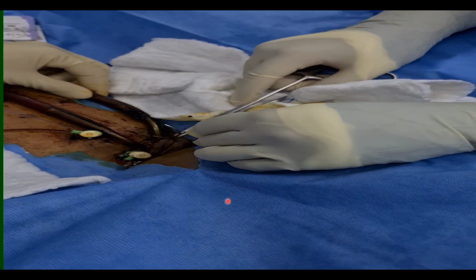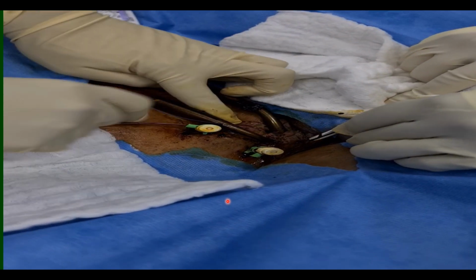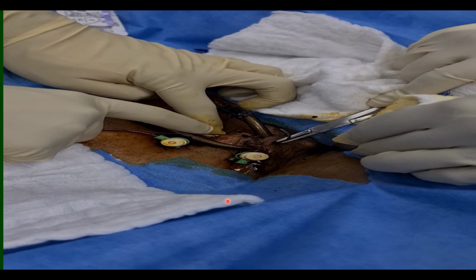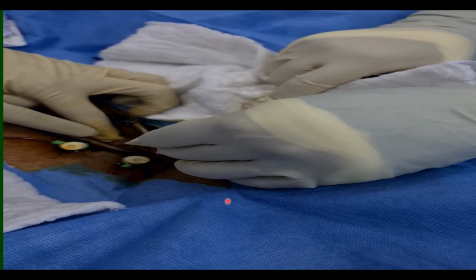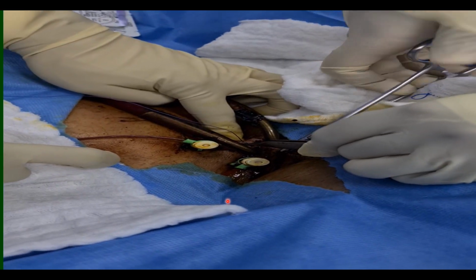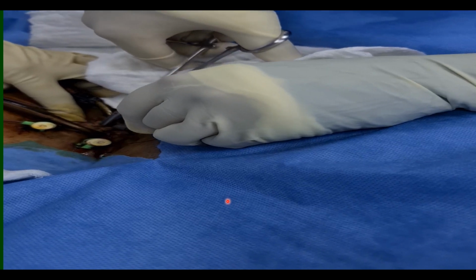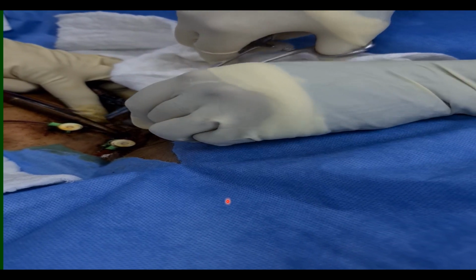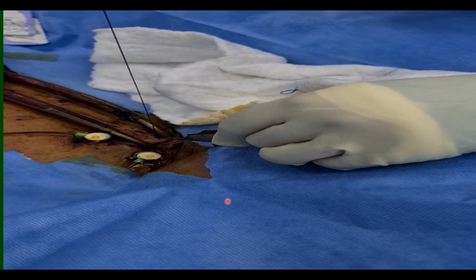During decannulation, the patient is fully monitored on the monitor. We can take video capture of the monitors, but I wanted to concentrate on how they take the sutures around the cannula. These cannulas are inserted percutaneously in the ICU, and they are also removed in the ICU.